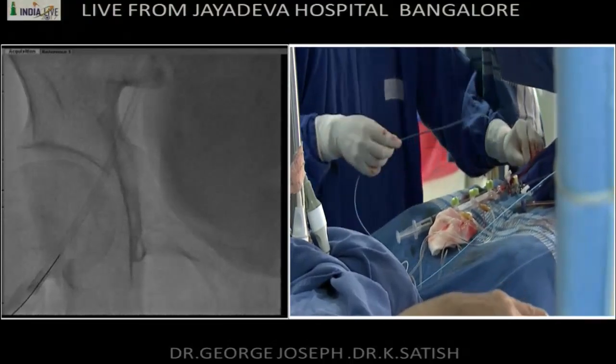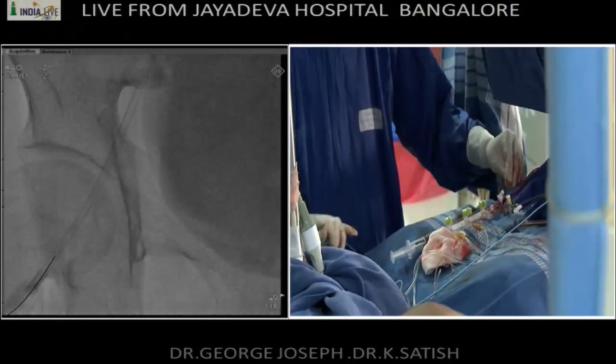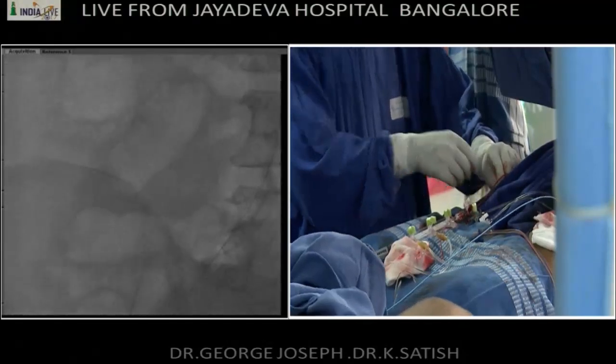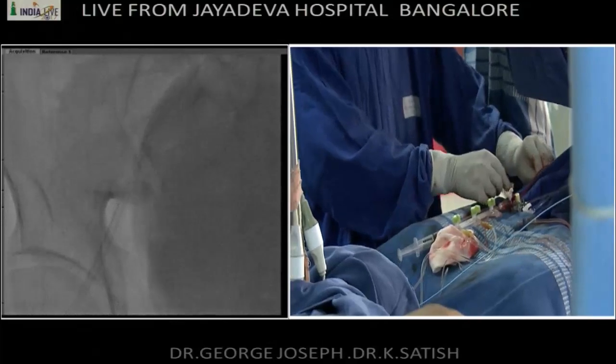Okay, so the wire has come out from the contralateral side. Keep feeding. Is this a normal length guide now, or do we have a shorter guide? Get enough out for me. It's a normal length guide, but this wire is the exchange length.